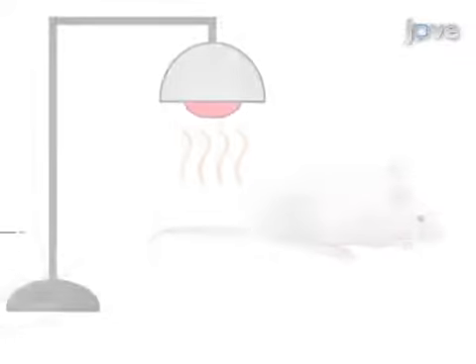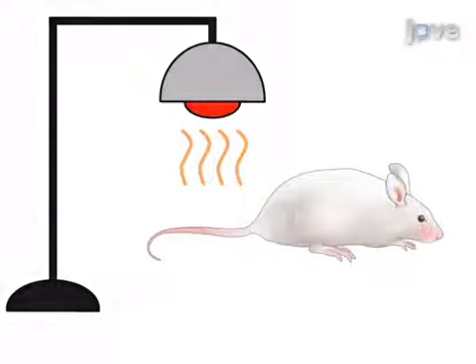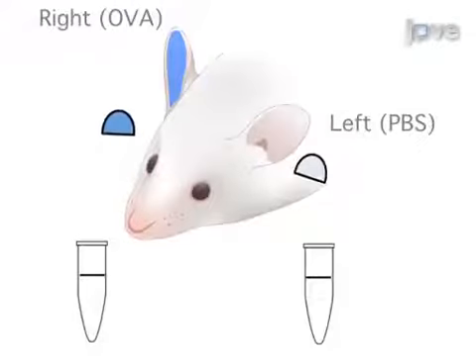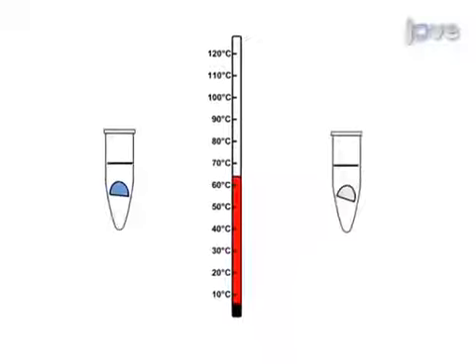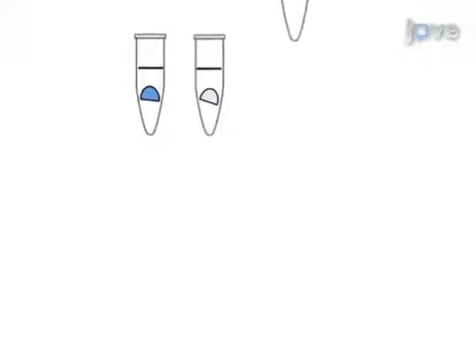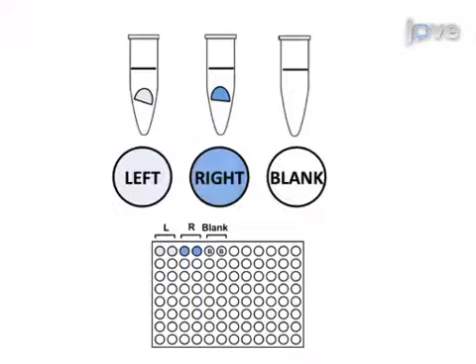Then Evans blue dye is injected into the tail vein. The final step is to extract the dye from the challenged ears by incubating them overnight in formamide. Ultimately, spectrophotometry is used to quantify the amount of dye that entered the ear.